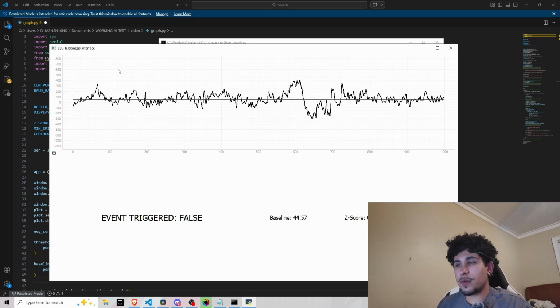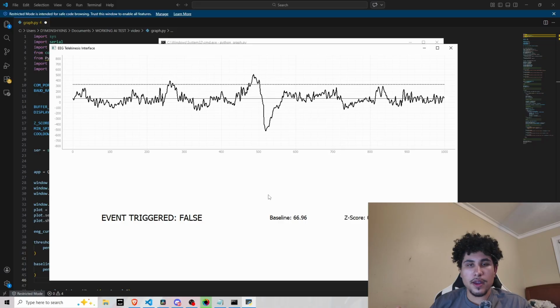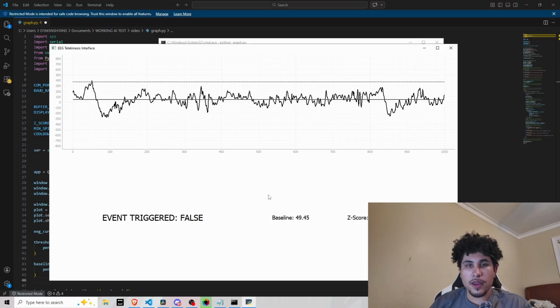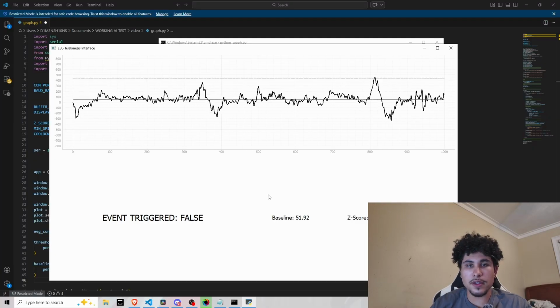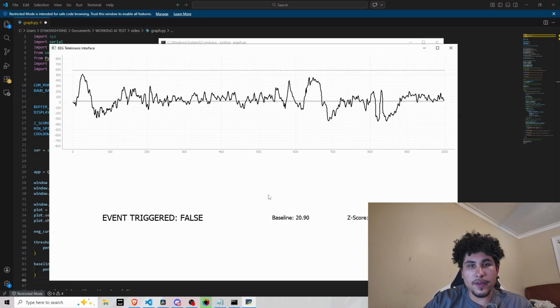Now on this graph, I want you to pay attention to this baseline value. The baseline value is important because it kind of compares my current brainwaves to previous brainwaves in this sequence of the last few seconds. The reason that's important is because if that baseline value is elevated, the program recognizes that as me being more focused. If the program recognizes that I'm more focused, it'll signal the Arduino to close the finger.